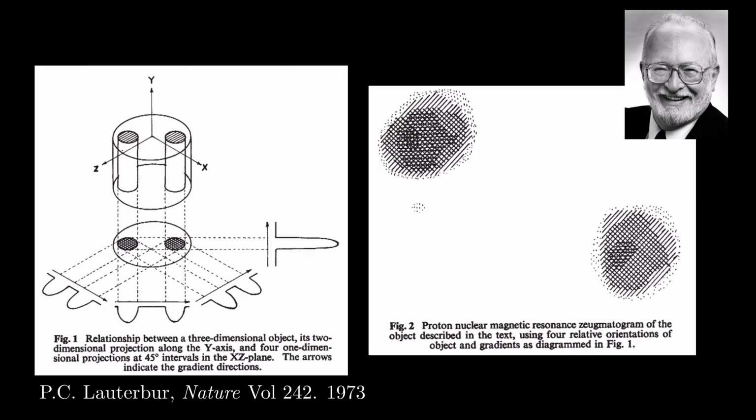If you're thinking along those lines, then you have the exact idea Paul Lauterbur did when he published the very first MRI in 1973. This technique is called back projection, and it's pretty much the exact idea behind how a CT scanner reconstructs images.